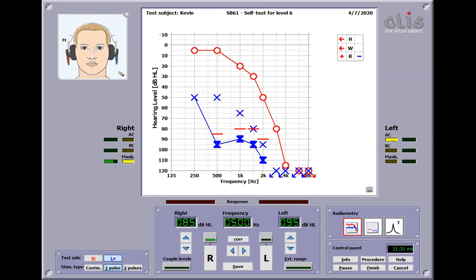Yes. Okay. So by the way, if there's no 30 dB plateau, but there's only 25 dB plateau, it's fine. We still accept that. But make sure you write a note in your report, your GP report, or general... I can't remember the name of it. Like the clinic report, not like clinic report, but anyway, clinic notes. Yes, clinic notes.